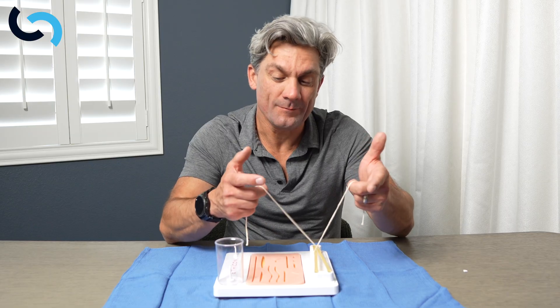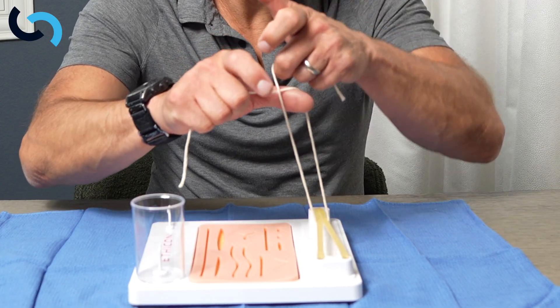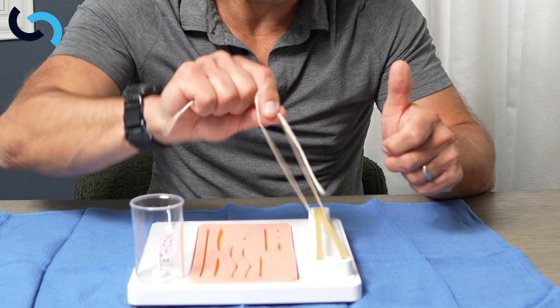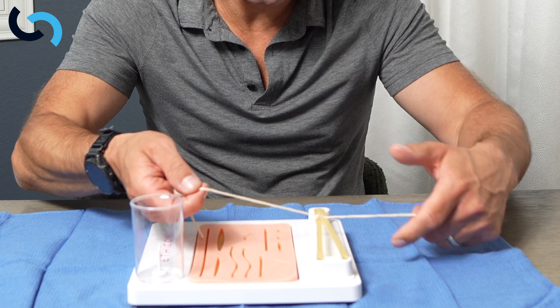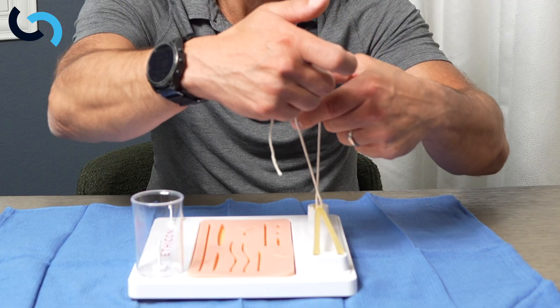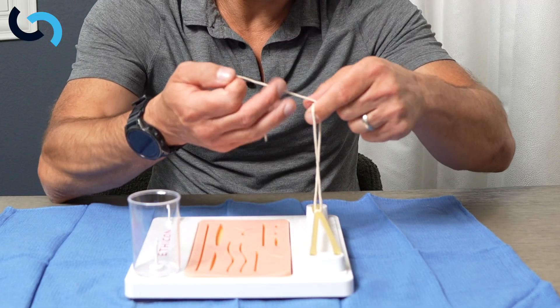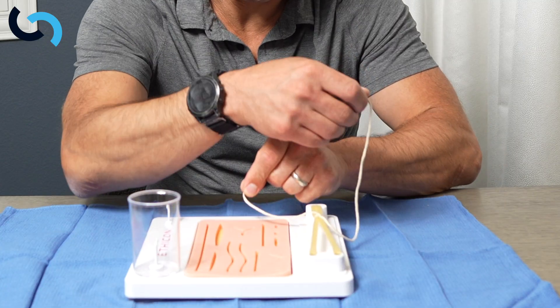The first move is the thumb comes under the string, we cross over, put our finger through, grab it with our thumb, and then we push. You can see that lays that knot down square. The second is putting it on the index finger, crossing over, thumb through, index down, back — and now we cross our hands, and we have a nice square knot.